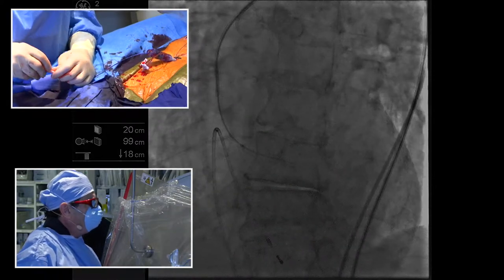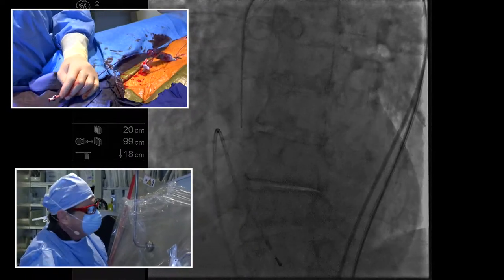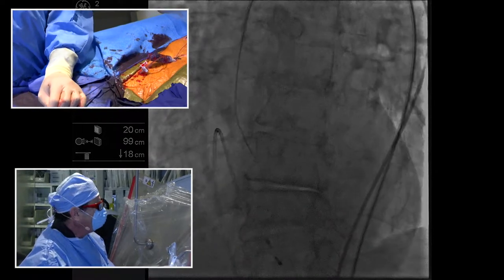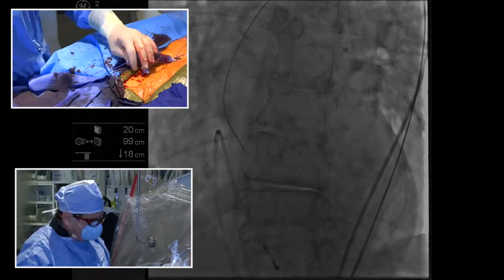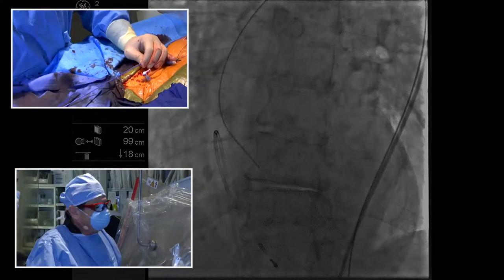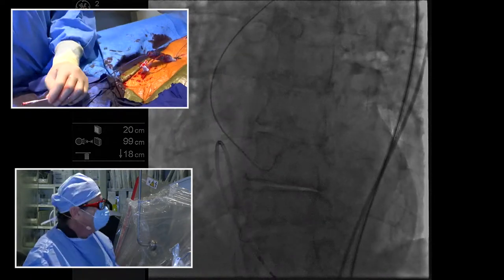But how are we doing with the Terumo? We're chasing it out. Okay, so if it's going to take you time to get that, let's do this. Let's take this out. Yeah, you know what, this is long enough, right? Yeah. So I'll just leave it here and be careful with it. Okay, we'll just keep it here and be careful with it. JR4 diagnostic. You can take that out. Okay. You have it or not? They don't have it yet. Wait. They don't have it. Let me keep trying. You have it? Okay. Good.